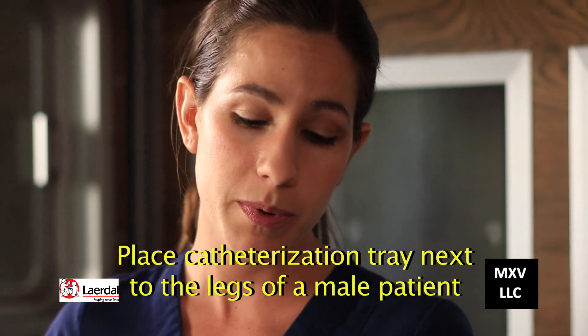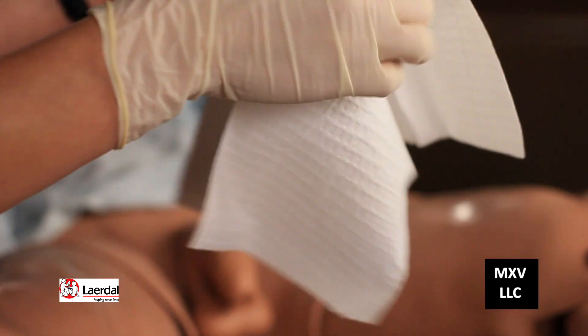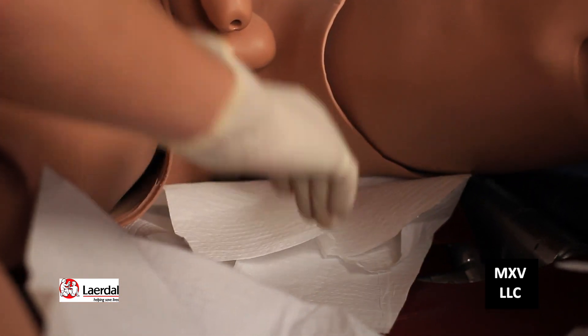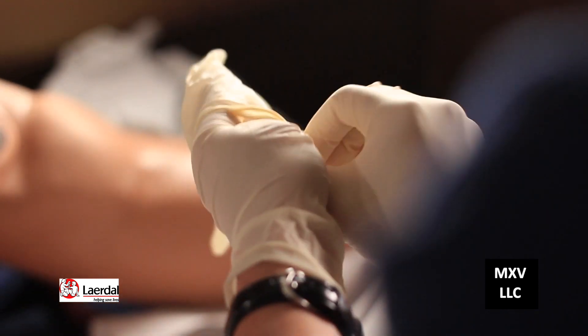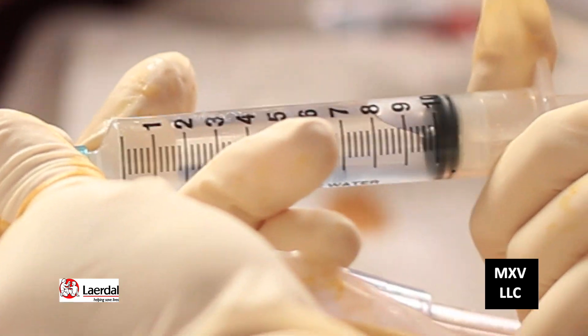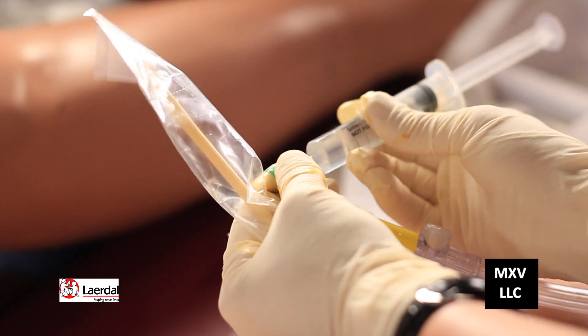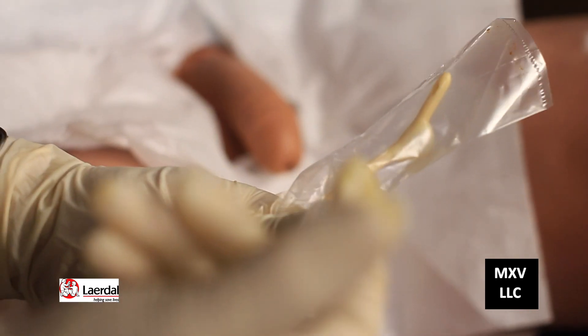Now I'm going to demonstrate how to do a Foley catheterization. Here's our Foley cath tray — this is a sterile procedure. Go ahead and pull the gown up and ask the patient to spread his legs; we have a drape under his butt. The sterile gloves are right on top — go ahead and put those on. We're going to drape this over the patient. Using sterile technique, take the syringe with 10 milliliters of sterile water to test the balloon for patency.